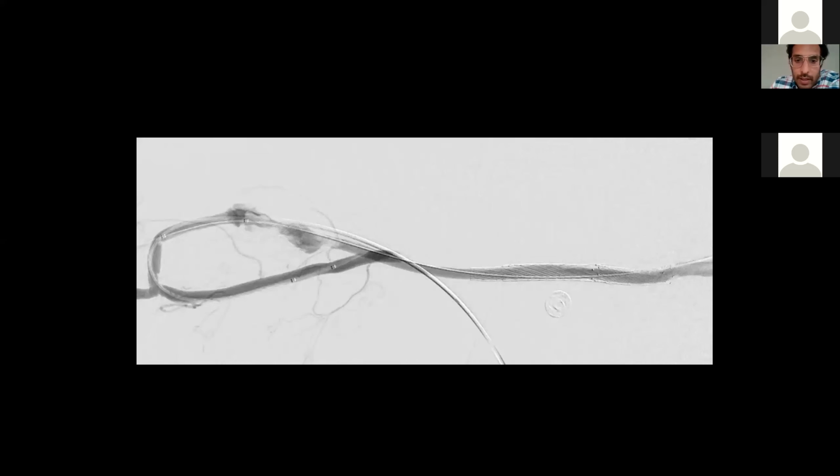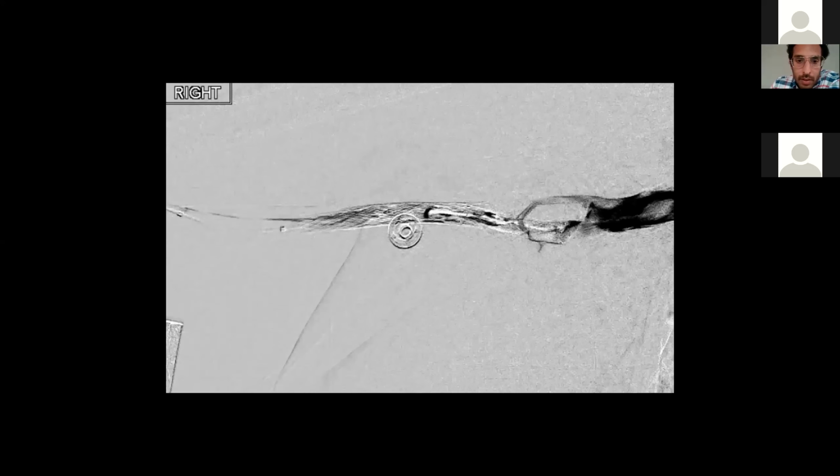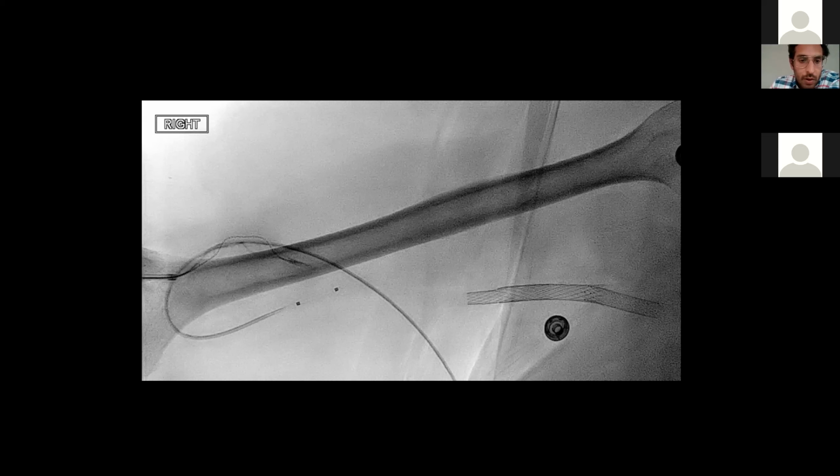So in this one, we didn't use thrombectomy or cleaner primarily. But once we pull the plug, you can see now that there's residual clot within those two small graft aneurysms. And this is just a video of us doing the cleaner in there. So this is just showing that you can do it even with the wire beside it. And that's post cleaner. Looks nice and open there.